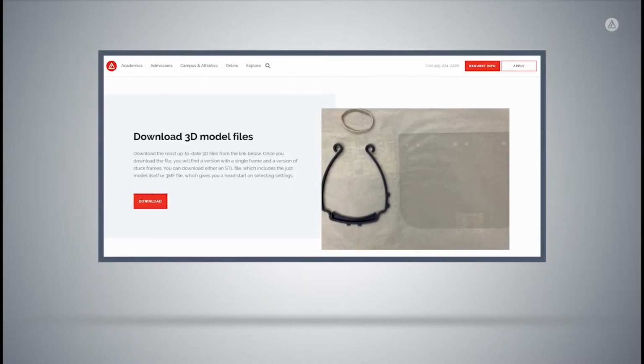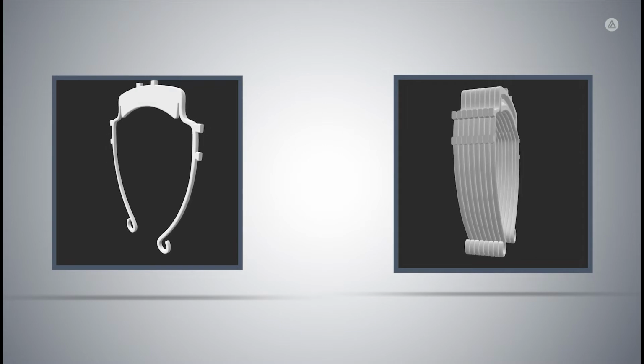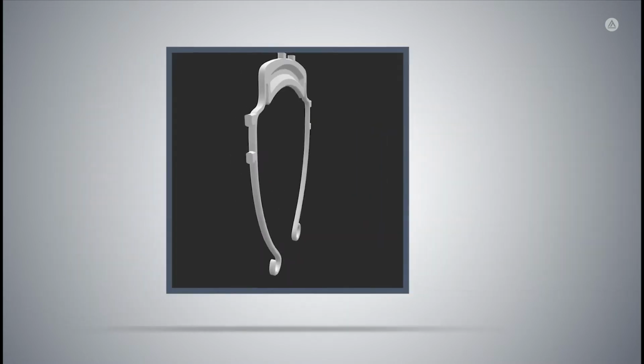Download the most up-to-date versions of the 3D files we prepared. You'll find a version with a single frame as well as versions with stacked frames. It's best to try the single frame first to dial in the settings for your printer. You can download either the STL, which includes just the model itself, or download the 3MF file, which will give you a head start on selecting your settings.